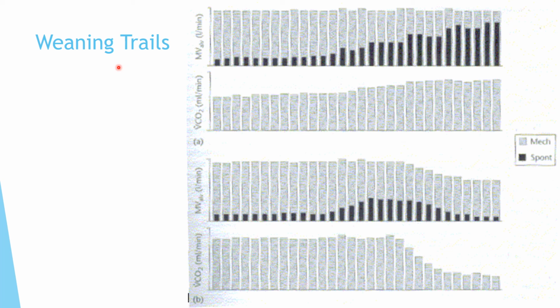And this is some weaning trials you can do. These are just two patients, A and B. So this is the guy in bed 1, put him on his trial. Say we'll say a patient bed 1 and 2. Bed 1, put him on his trial. Bed 2, you went next door and flipped him over to. They're breathing. Oh, participating more.